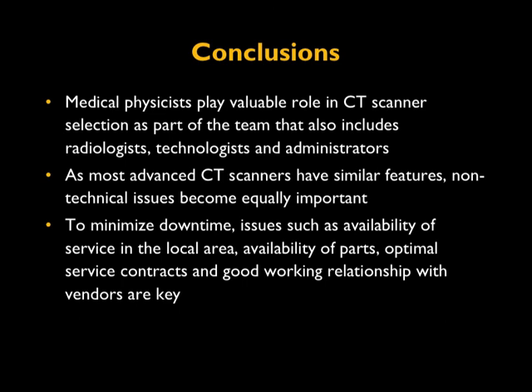So the medical physicist can play a valuable role in CT scanner selection as part of the team that also includes the radiologists, technologists, and administrators. As most advanced CT scanners have similar features, non-technical issues become equally important, such as minimal downtime and the tangible benefits a particular manufacturer provides, which can weigh heavily on the selection. At the end of the day, it's important to minimize the downtime.